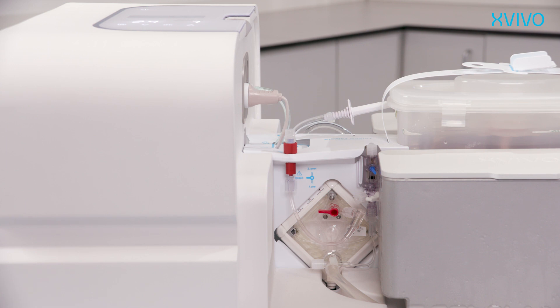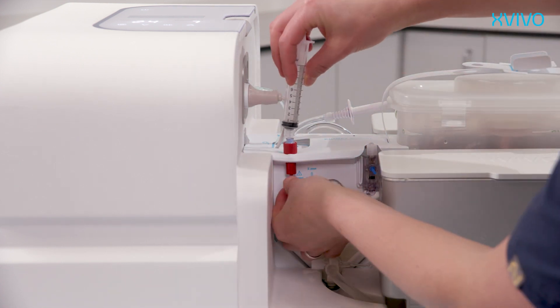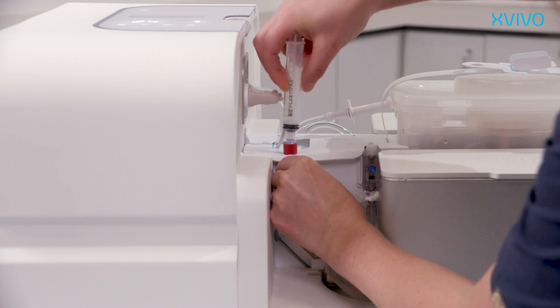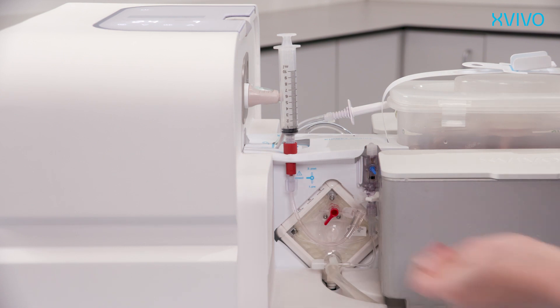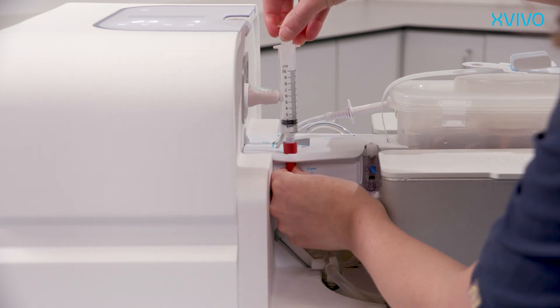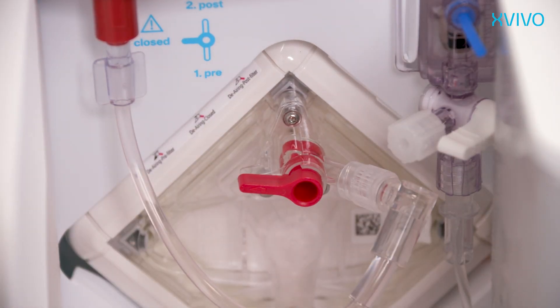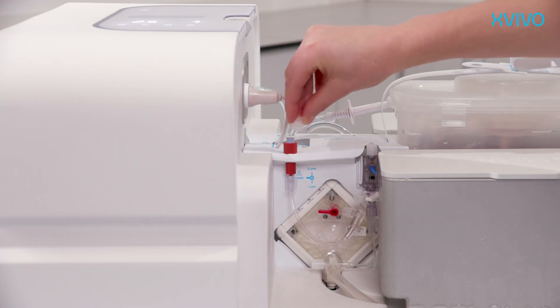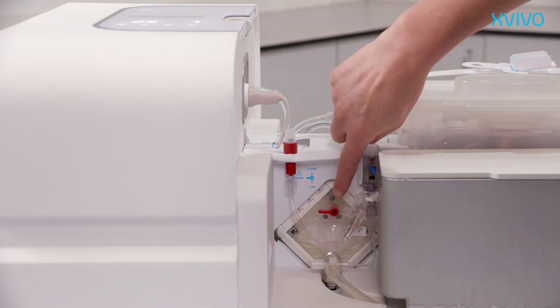Sampling of the perfusion fluid is performed via the sample port by using a syringe. Take off the cap and connect a sterile luer lock syringe. Open the three-way valve and take a perfusate sample by aspirating. Close the three-way valve and disconnect the syringe. Replace the cap on the sample port. After sampling, ensure that the valve is in the horizontal position.